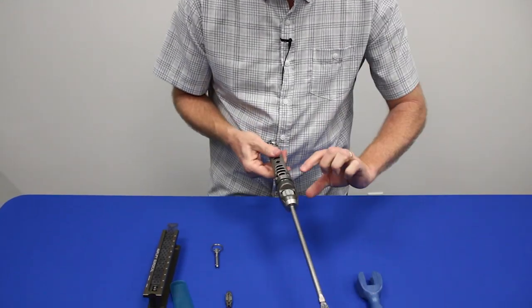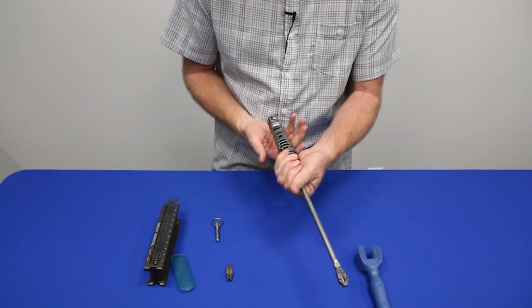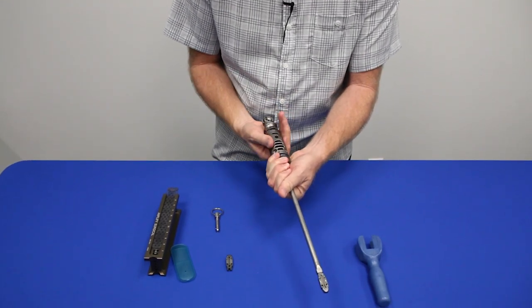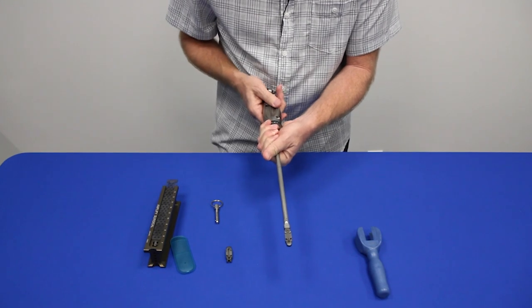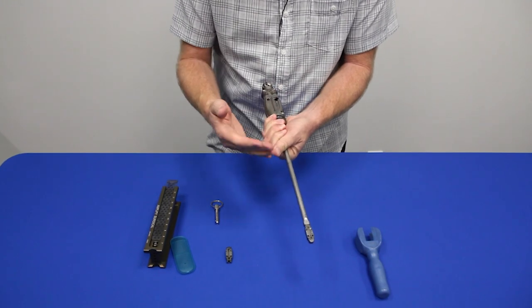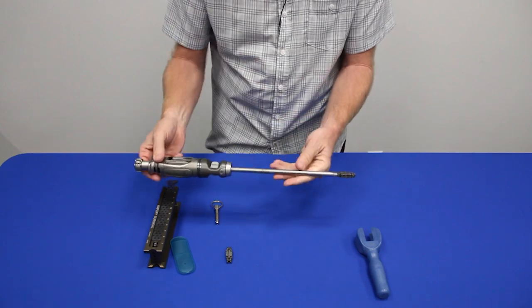We hold the counter torque portion of the handle and we turn the expansion portion of the handle counterclockwise and that draws everything together and collapses the implant in order to hand to the surgeon and is ready for implantation.